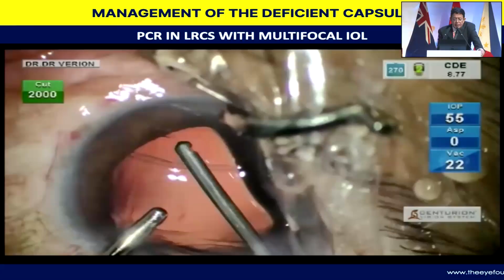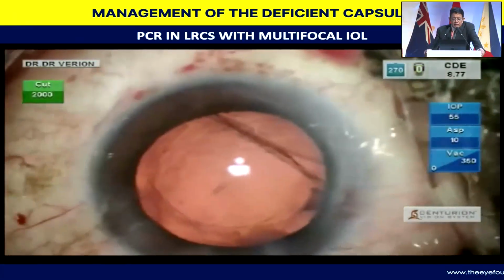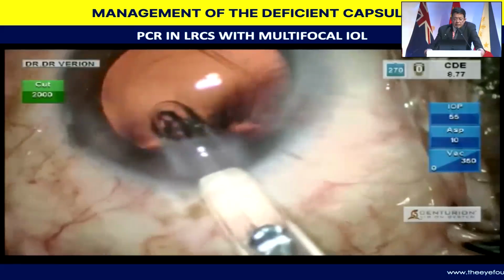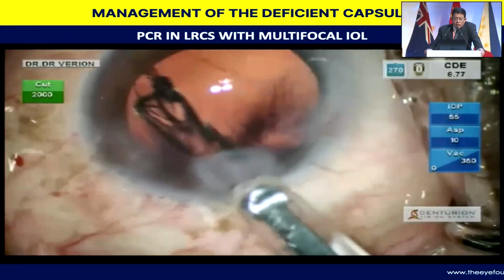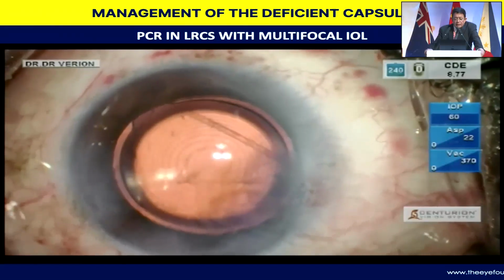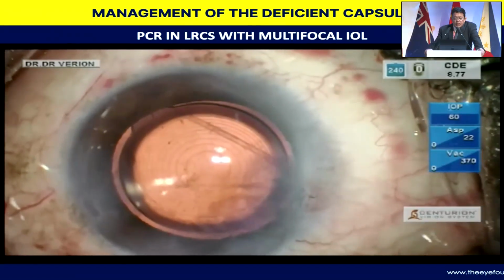And since the lady had already received a trifocal lens in the other eye, a continuous range of vision lens in the other eye, I go ahead and decide. And here I'm enlarging the incision so that I do not do a wound-assisted implantation. And I'm essentially directing the lens to the area where there's adequate capsular support. And in spite of this fairly large area of capsular defect, I'm able to implant a premium intraocular lens within the bag and get optimal results.